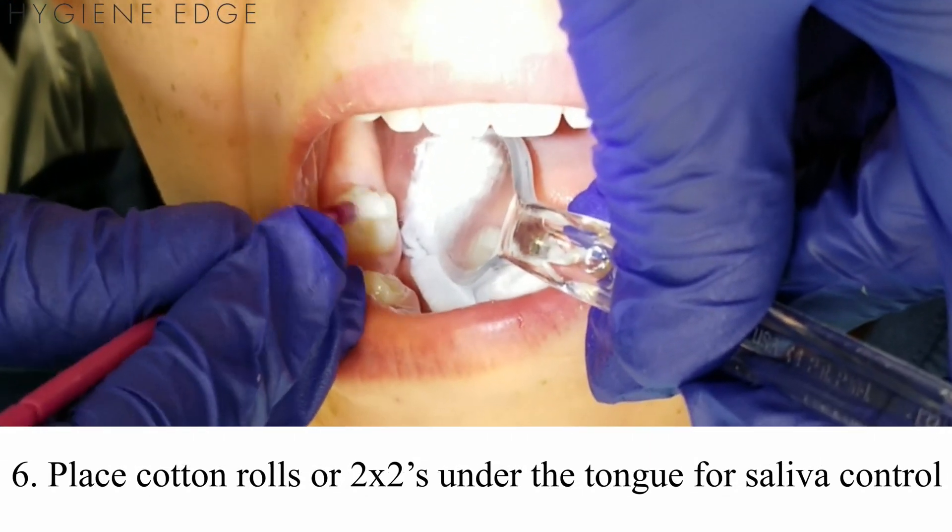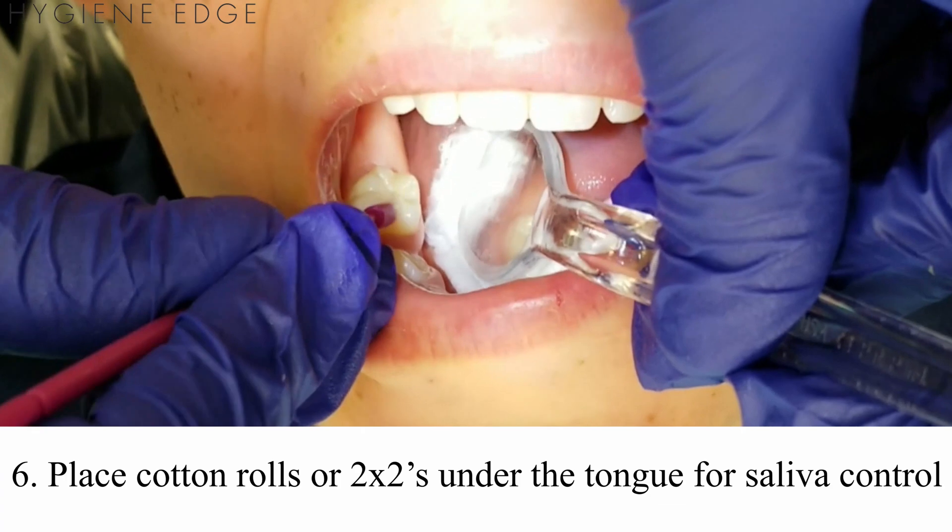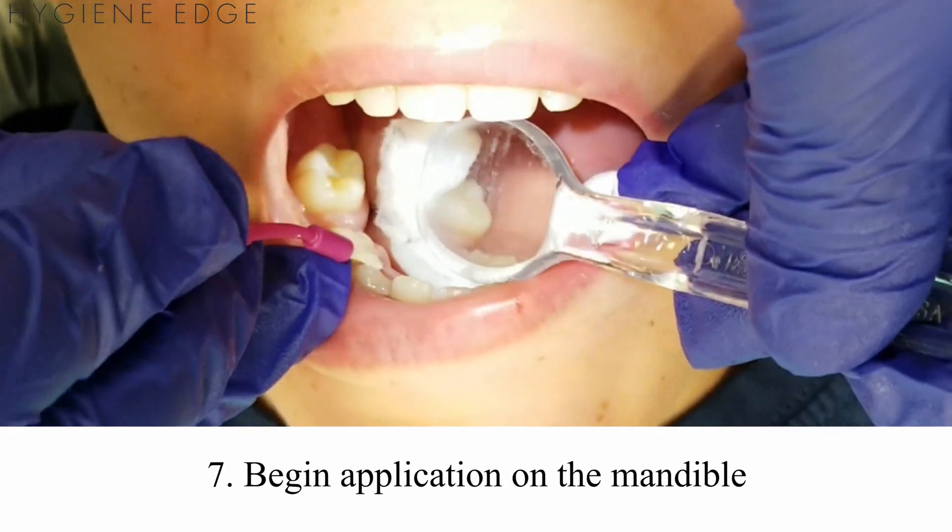Place cotton rolls or 2x2s under the tongue, then dry the teeth. This will decrease the pooling of saliva. When applying varnish, start on the mandible.